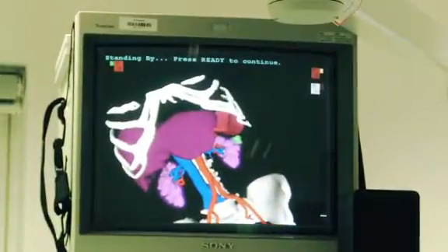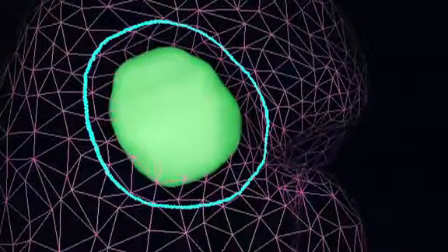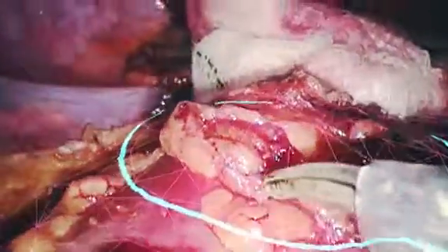The area of research we're using a lot here at Imperial is enhanced robotic operating environments, and a strong part of that is image enhanced operating. And what that means is we use imaging like CT, MRI and ultrasound to try and overlay onto the view we have in the robotic console. So the image enhanced operating environment is something that is progressing very rapidly.